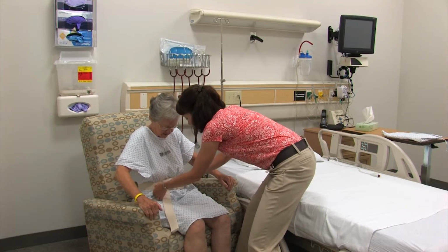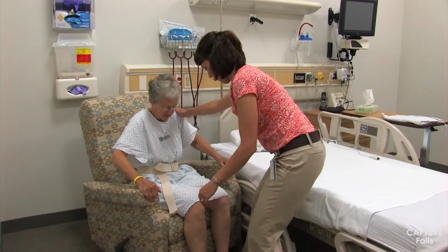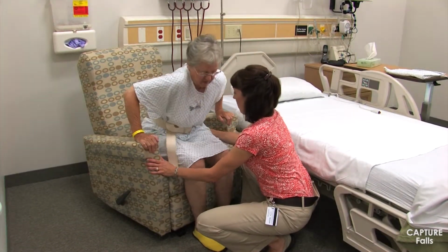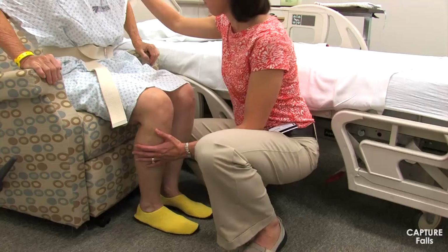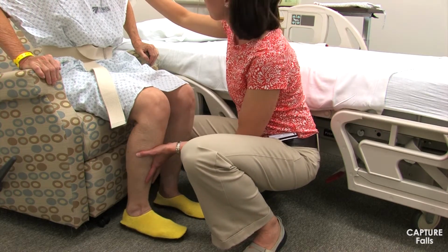The patient should have a gait belt fastened around her waist and non-slip socks or shoes on her feet. Her feet should also be positioned flat on the floor. You may need to have the patient scoot forward if needed to position her feet appropriately. Scooting forward also helps her get her center of mass over her base of support. The patient's feet should be positioned about shoulder width apart to provide her with a more stable base of support.